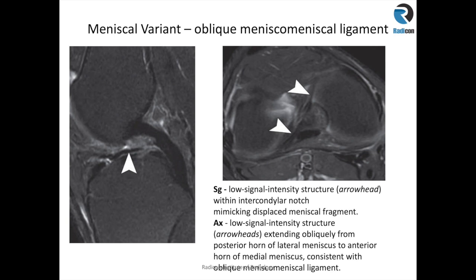The oblique meniscomeniscal ligament runs between the posterior horn of the lateral meniscus to the anterior horn of the medial meniscus. It can be seen on axial sequence, pointed by the arrowheads, or on sagittal sequence in the midline as a low signal intensity structure.